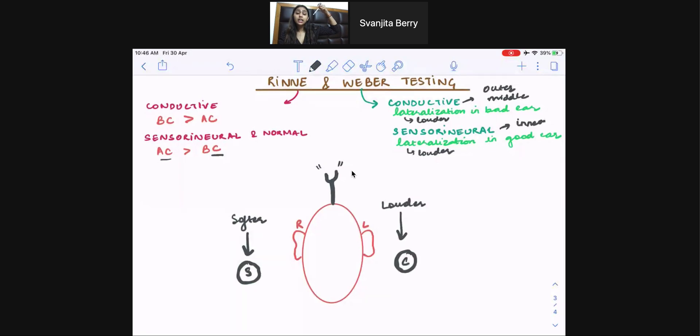If they don't hear it in air, that means bone conduction is greater than air conduction. And this is only seen in conductive hearing losses. So how I like to proceed is I like to do the Rinne testing in the conductive ear. So let's say I do my Rinne testing in the left ear.